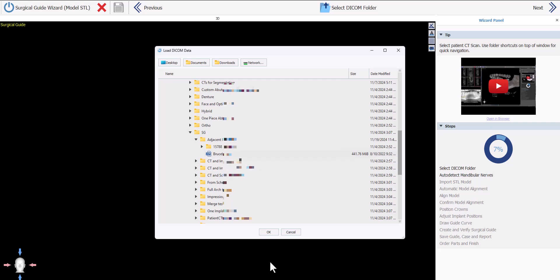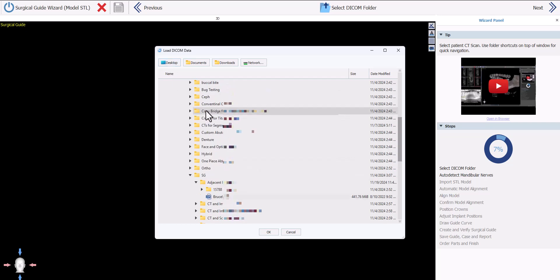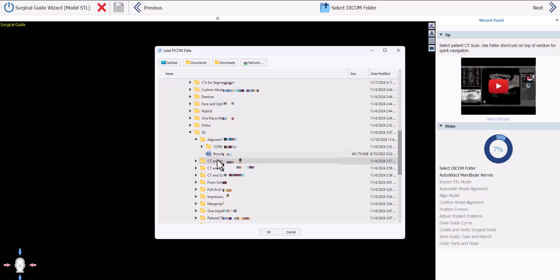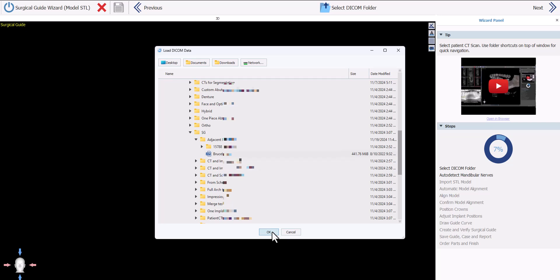The software is now prompting us to load the relevant CT DICOM data for the case. We have shortcut buttons across the top of the screen that can be used to quickly navigate to relevant locations, or you can navigate via the folder structure on your computer. BlueSky Plan can load compressed, uncompressed, zipped, and unzipped DICOM images. Select the relevant set and click the OK button.